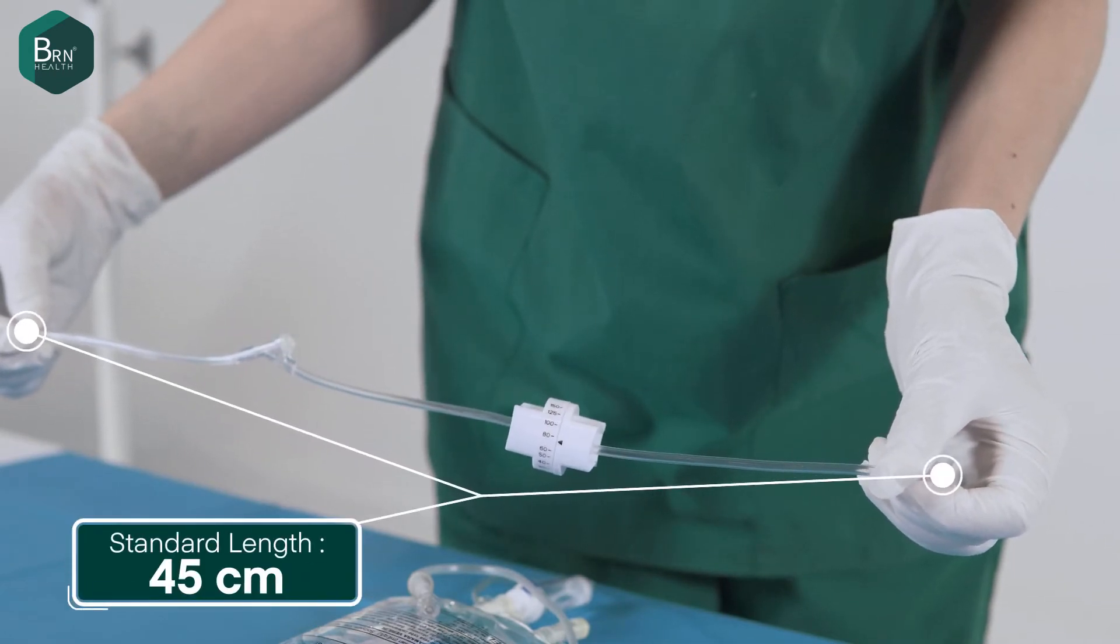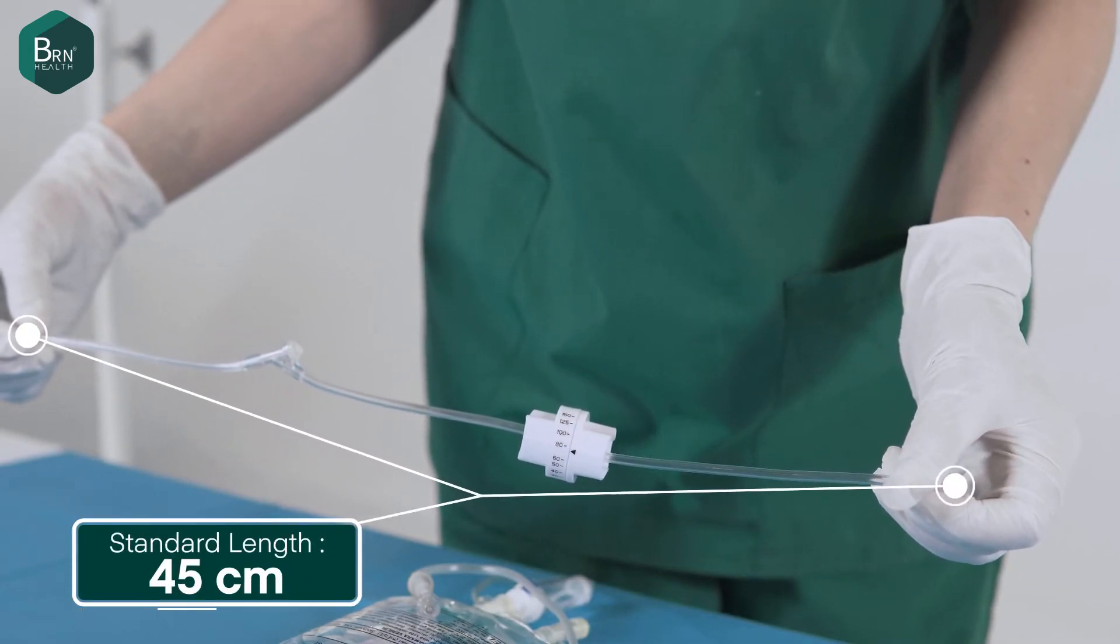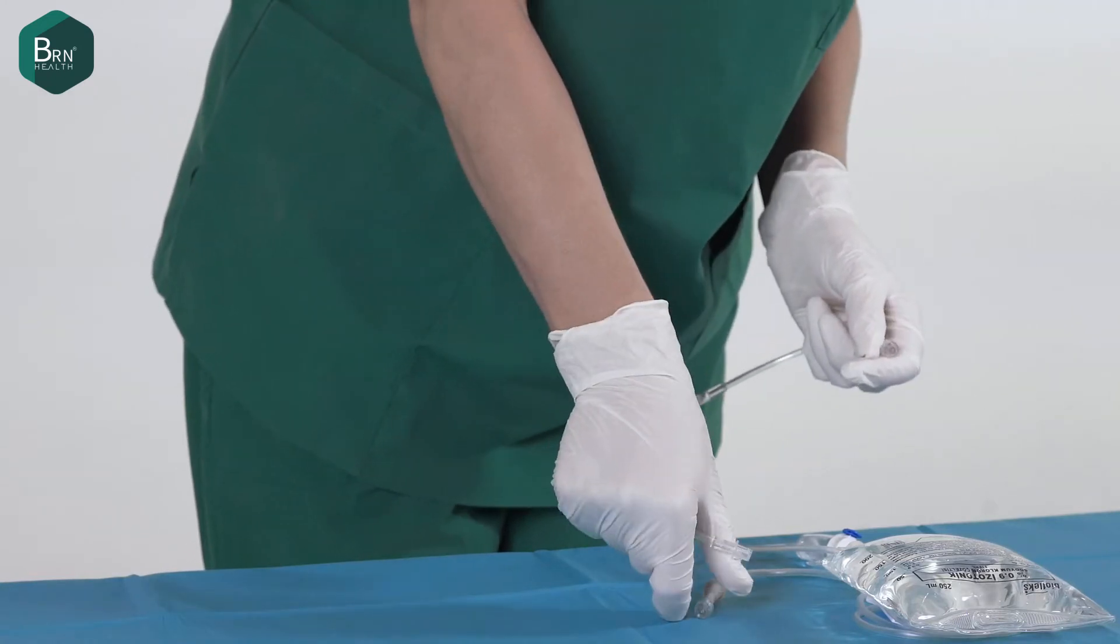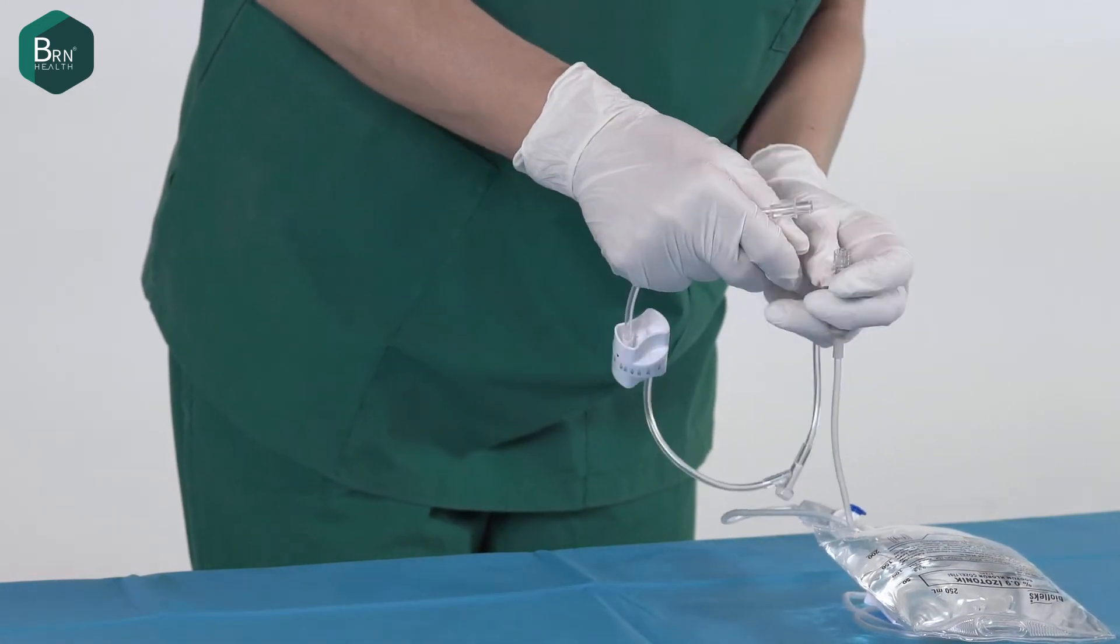Turning the adjusting knob clockwise decreases the flow rate, whereas turning it counterclockwise increases the flow rate.